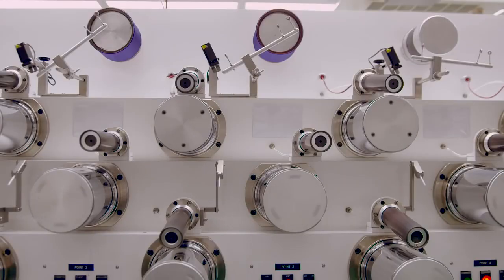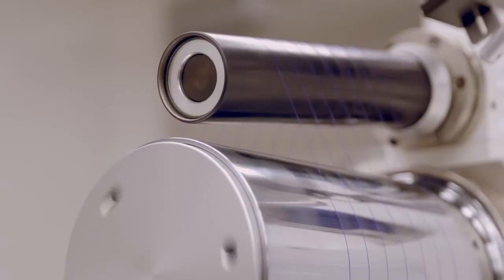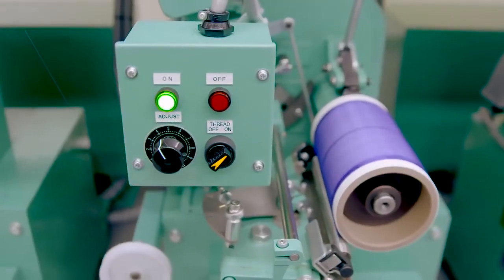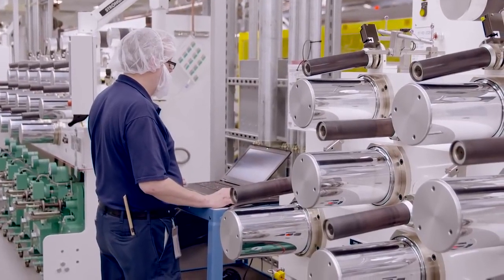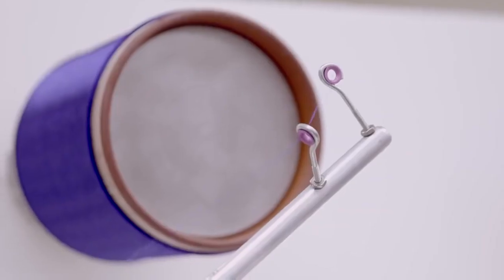The fibre is then stretched and rolled at different speeds. It is here that various properties like tensile strength are being set into the fibres. You know, it's like making spaghetti, but very important spaghetti. The care and control that each of the operators have in terms of making sure we're following our recipes appropriately. It's a pretty nice process.